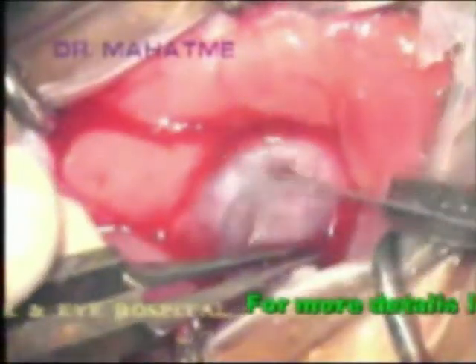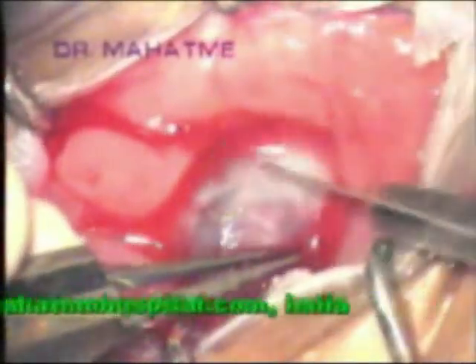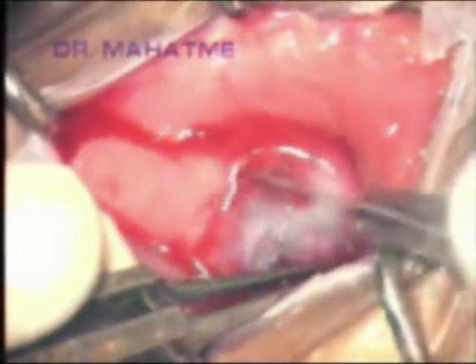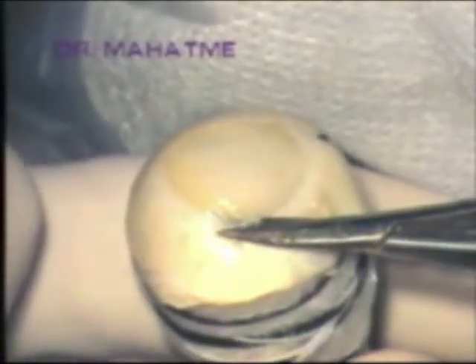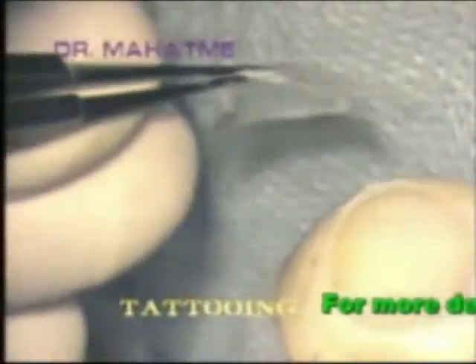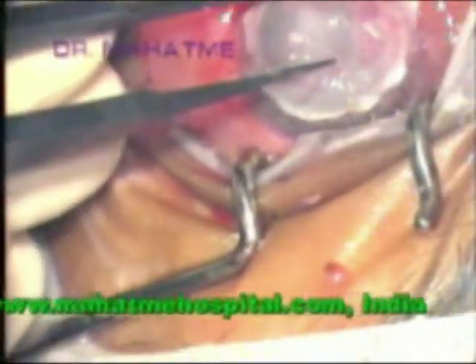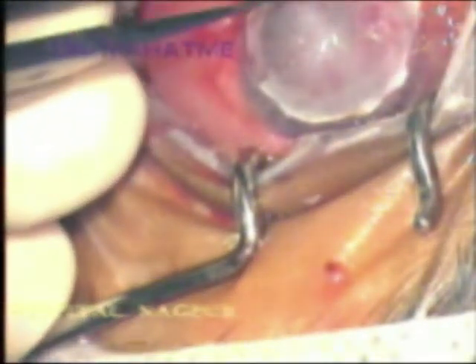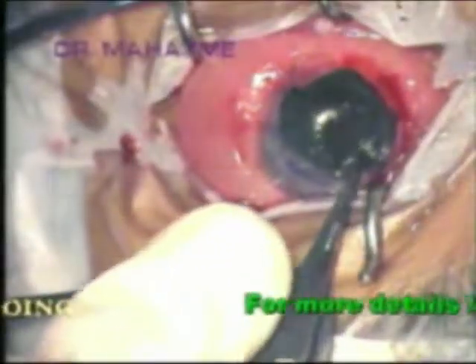If the opacity involves the whole area of the cornea, make a partial thickness incision in a circular fashion so as to separate the stem cells and the conjunctiva. Then take a lamellar graft of the superficial 1/3 thickness of a glycerol preserved cornea. Tuck this graft below the stem cells and conjunctiva. If the opacity is small but dense and superficial, then tuck the graft as in epikeratophakia.